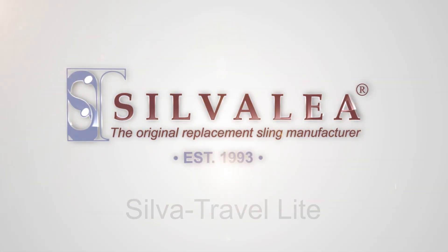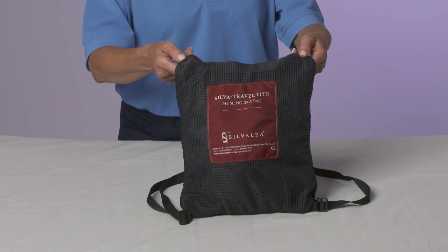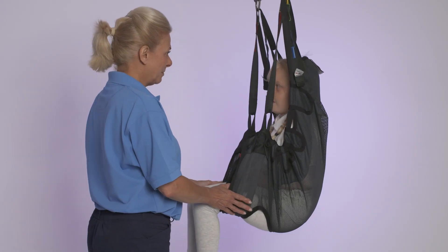Silvalea is dedicated to helping everyone enjoy the most independent life possible. That's why we created a lightweight portable transfer sling, the Silva-Travel Lite, a product that can be used both as a manual or hoistable sling.